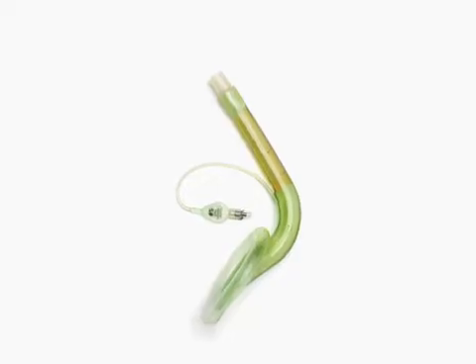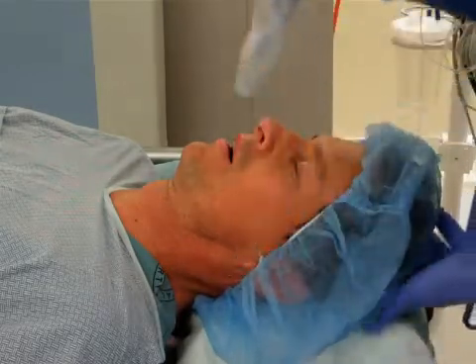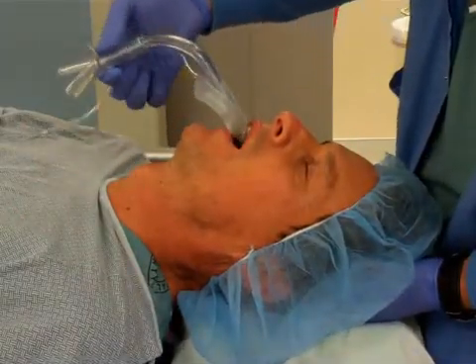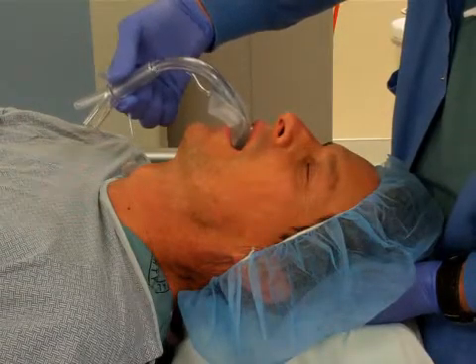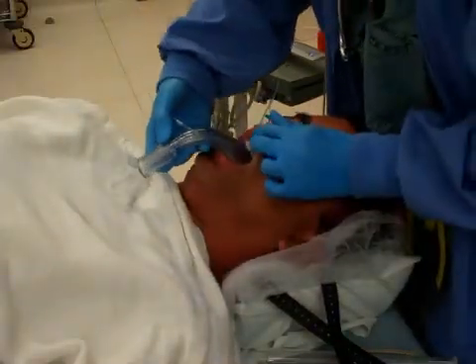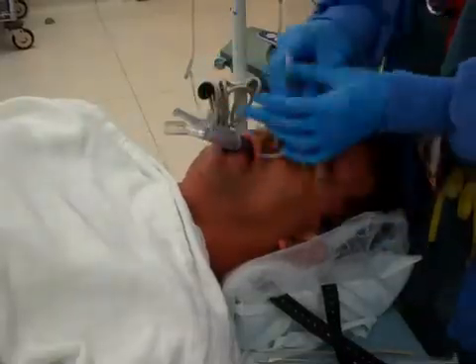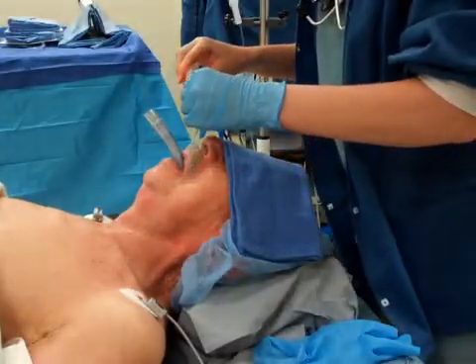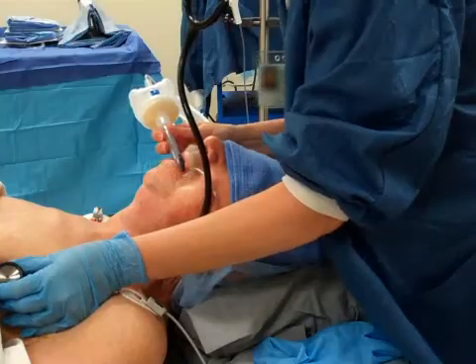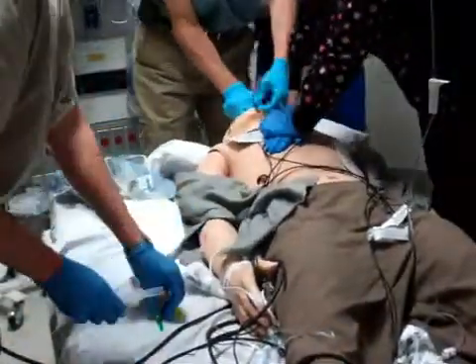Use of a pre-curve laryngeal mask airway sometimes allows placement without the need to insert hands inside a patient's mouth. Grab the connecting tube with your dominant hand so the cuff points to the patient's head, with your hand in a neutral position and thumb on the upward surface of the tube. Guide the LMA above and behind the tongue by applying firm pressure along the patient's hard palate, then guide the tube toward the larynx with a circular motion of the hand. After placement, inflate the cuff, connect the device to a positive pressure ventilation system, and confirm proper placement by auscultation of breath sounds, which should take less than five seconds and should not require interruption of CPR.